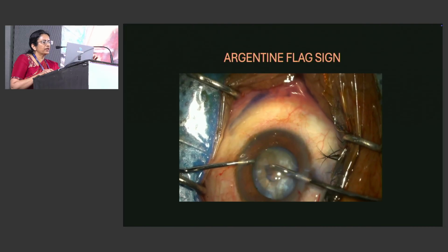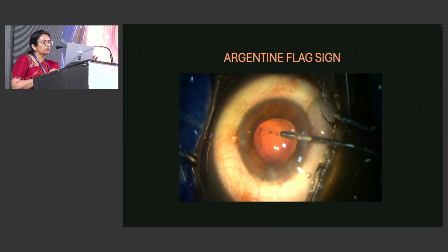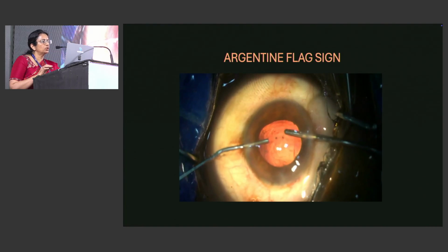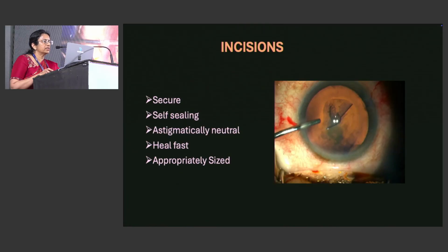And the phacoemulsification was done using low parameters. If you see here, the flap is motile and then it is everted. So this means the rhexis extension has not gone onto the posterior capsule and so you can safely place an intraocular lens inside the bag.